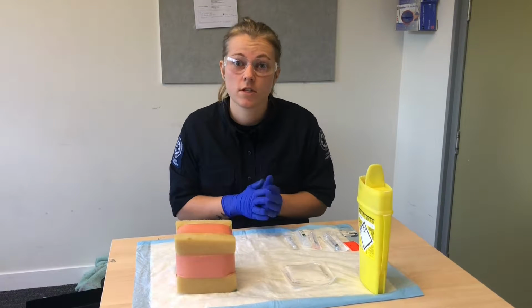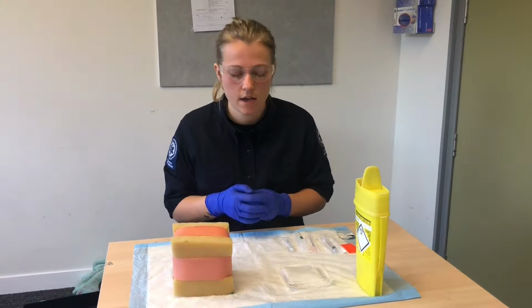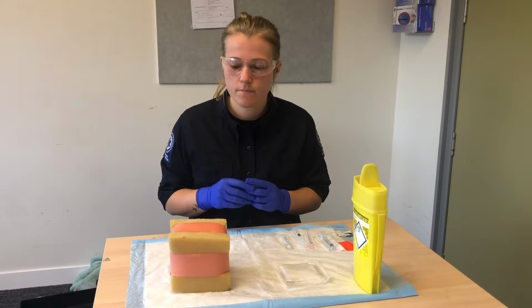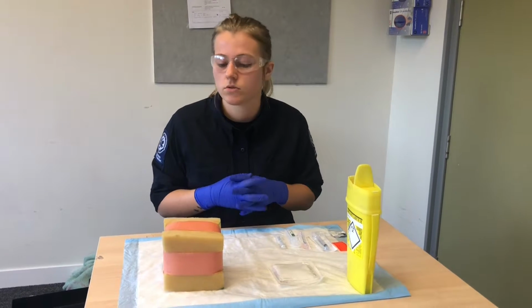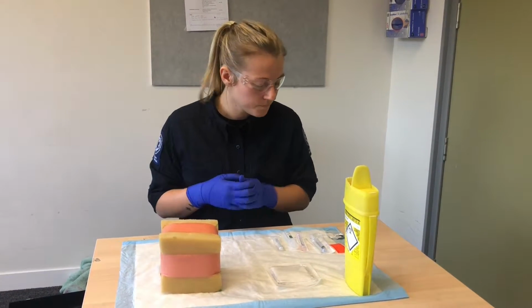Lignocaine is used as a local anaesthetic and is used prior to IV cannulation, and especially for those anxious patients and children. Before I use the lignocaine, I want to gain consent from the patient and also ask whether they have any allergies, especially to medication.